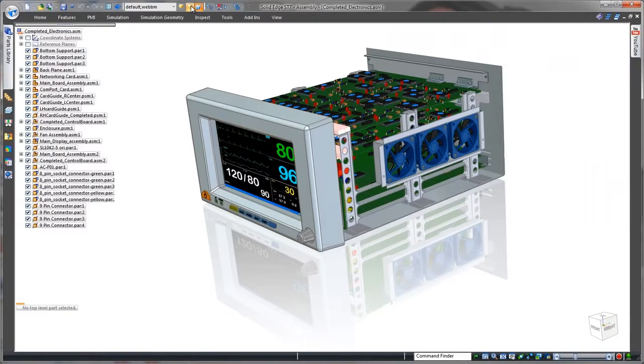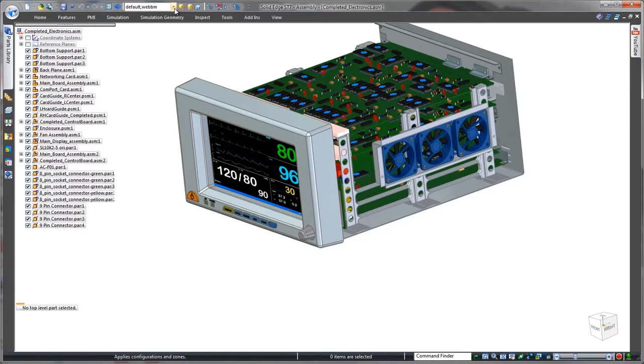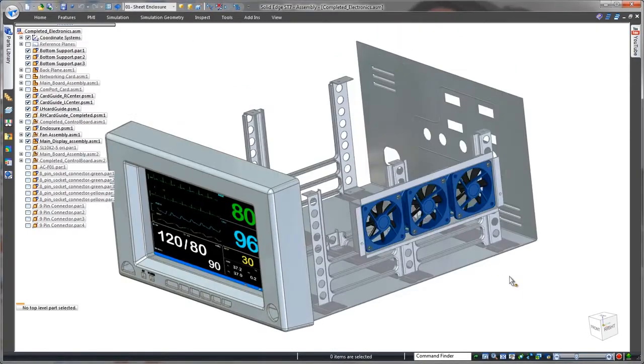We'll use Solid Edge to complete the enclosure of this heart rate monitor. Solid Edge with synchronous technology excels in sheet metal construction, allowing designers to efficiently work with surrounding components to define external product housings.